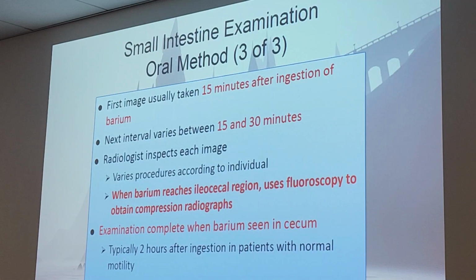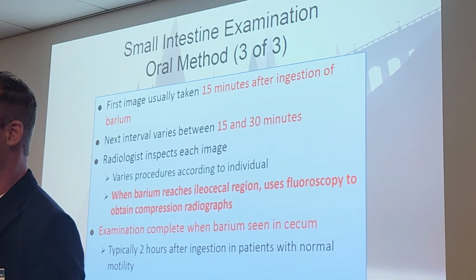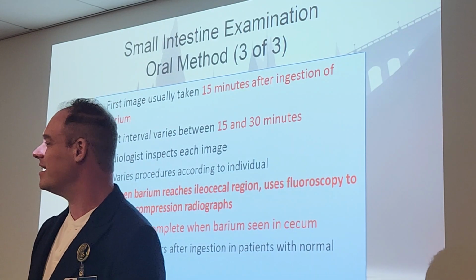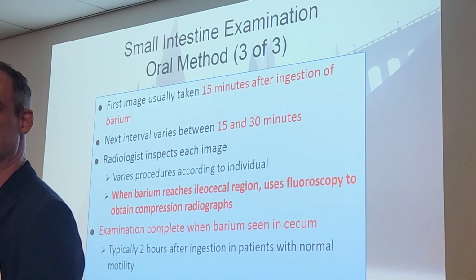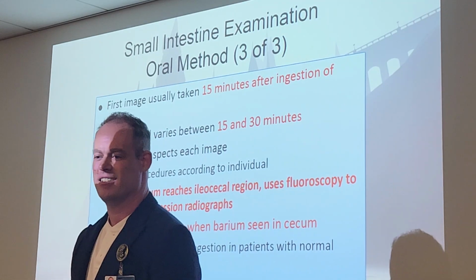Oh, I didn't tell y'all on the upper GIs and small bowels, a little trick you can help your patients with. For upper GIs, they're of course looking for barium to get to the C loop, and sometimes it just sits in the stomach for a while. Same thing with the small intestine, you want to get to the ileocecal valve, and it's just sitting in there. They say, tell your patients to think of their favorite meal. That can stimulate the contents to move a little faster sometimes. With kids, it's always really fun. They say pizza and candy and ice cream and things like that. You tell them to imagine they're eating their favorite food, and sometimes you just see the barium go, whoop, and start moving. Works pretty good. So is that the mind releasing a hormone or? It's stimulating the peristalsis. Cool. Yes.